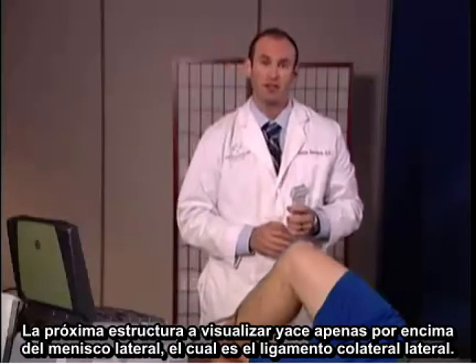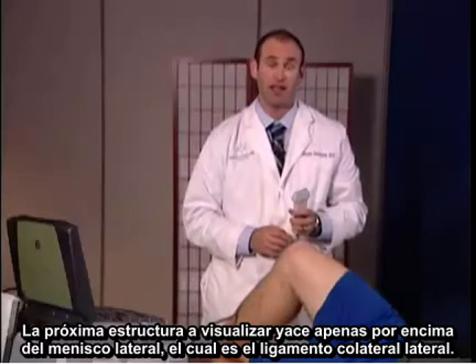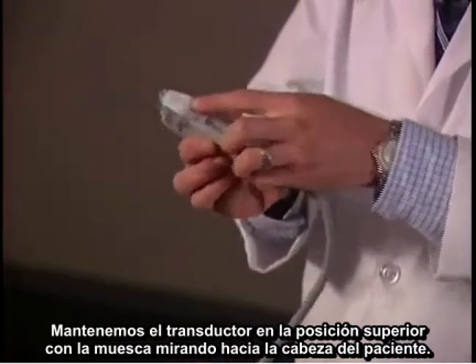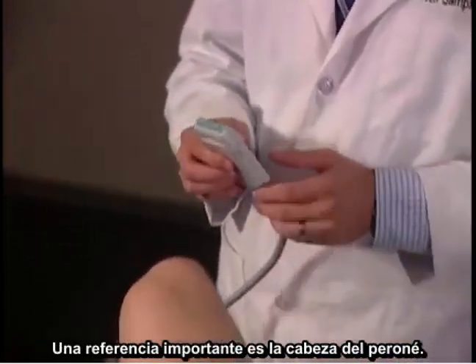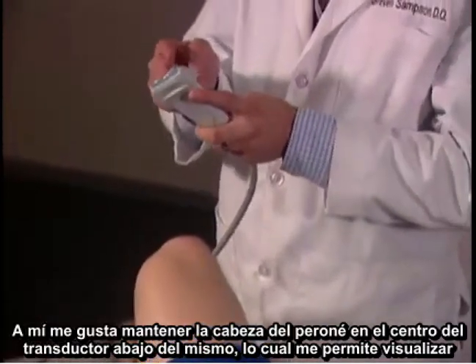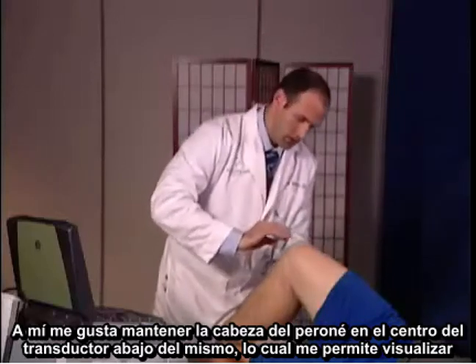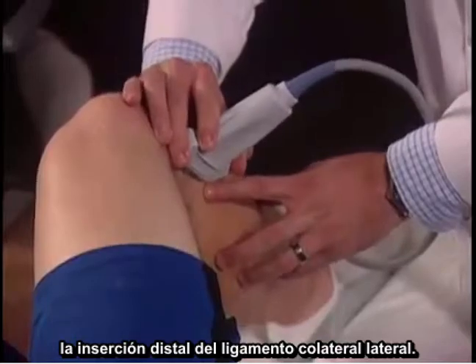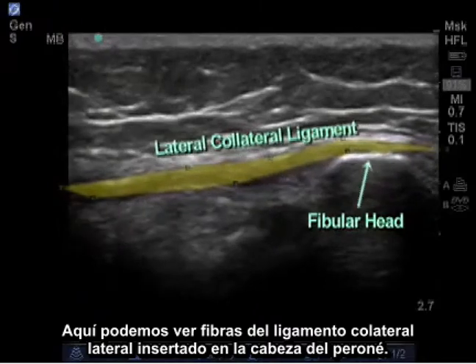The next structure to image lies just above the lateral meniscus, which is the lateral collateral ligament. Maintain the transducer in the superior position with the notch facing towards the patient's head. An important landmark is the fibular head. I like to keep the fibular head in the center of the transducer beneath it, which will allow me to visualize the distal attachment of the lateral collateral ligament. Here we can see fibers of the lateral collateral ligament attaching on the fibular head.